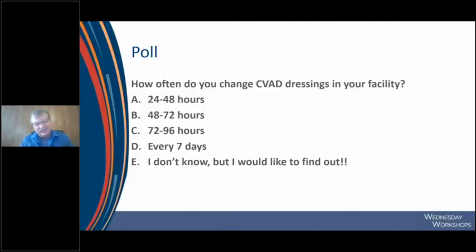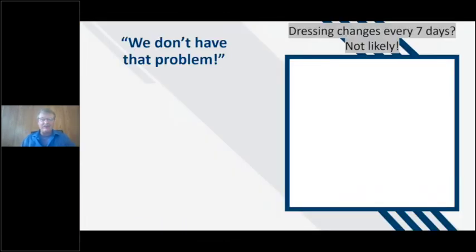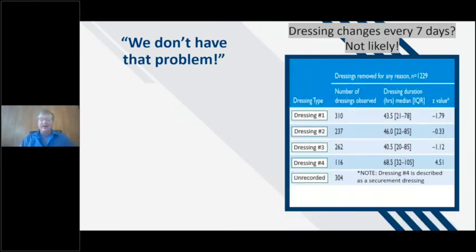But this question doesn't ask how often your policy says to change your dressings in your facility. It's how often they really are changed in your facility. And it's much different. Most people think, we don't really have a problem with that. But the likelihood of your dressings lasting 7 days is really the exception.